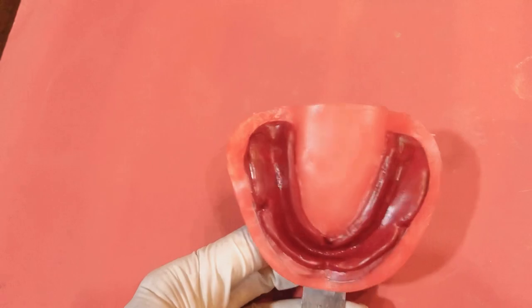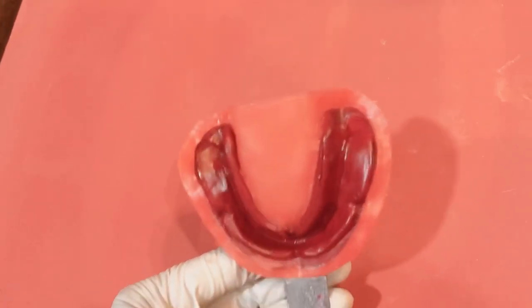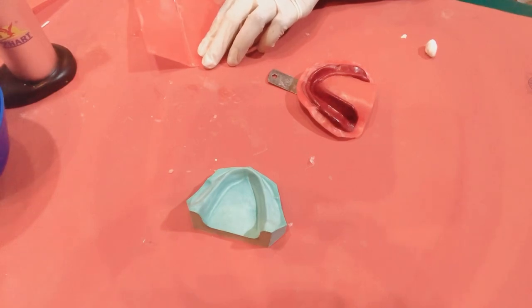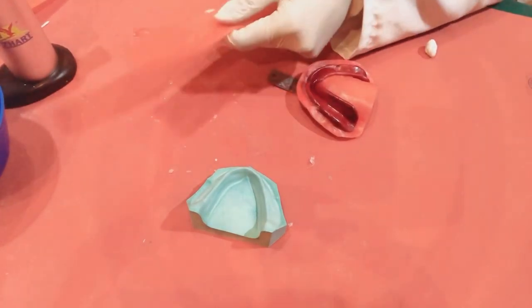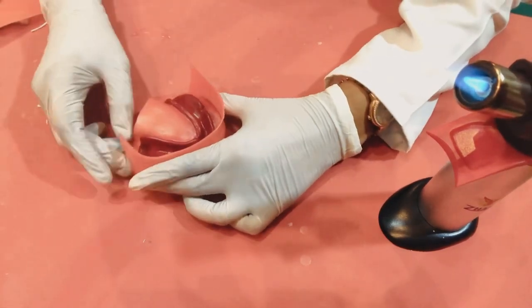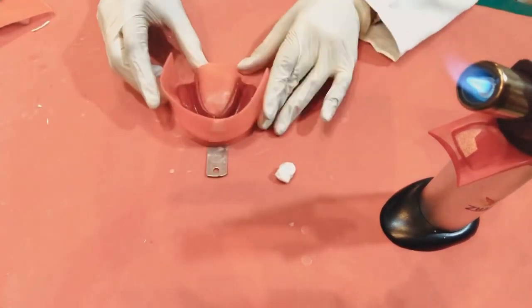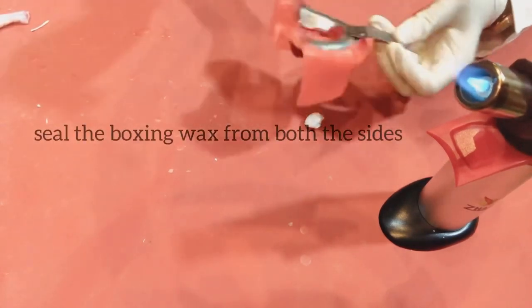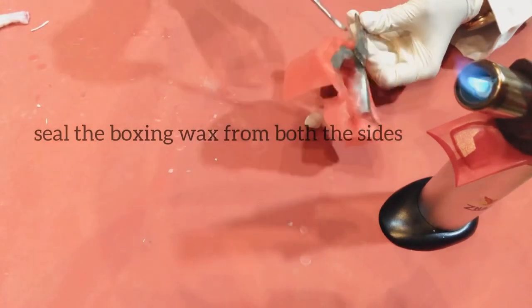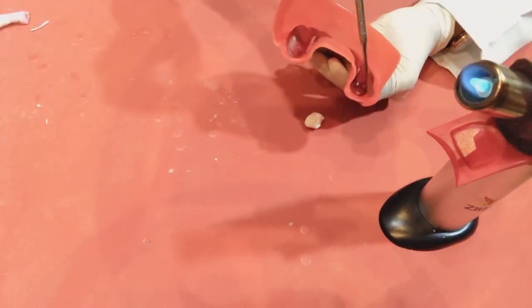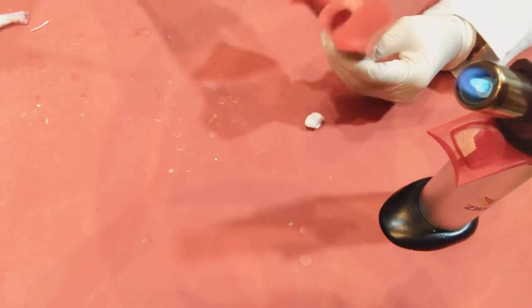Make sure it's of uniform width two millimeters below the margins, following the outline of the impression, removing any excess, and when it's good enough we can proceed with boxing. Here I'm not using boxing wax as shown in the video of maxillary impression. I'm using the same modeling wax sheet for boxing too. Seal the boxing wax sheet to the beading wax.